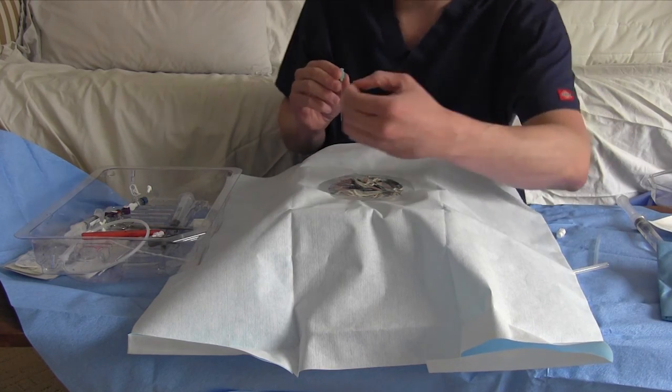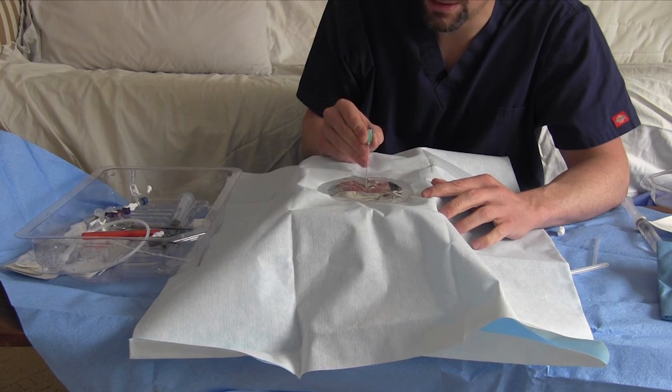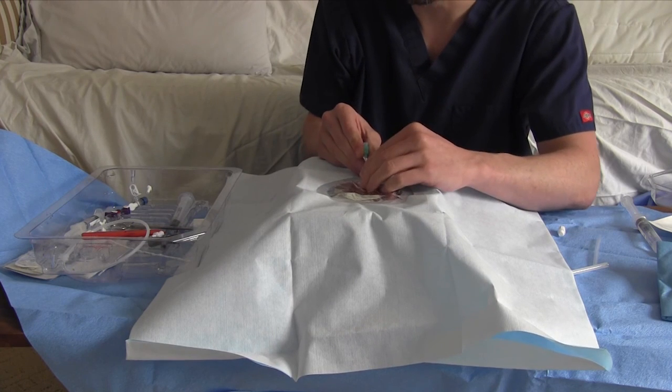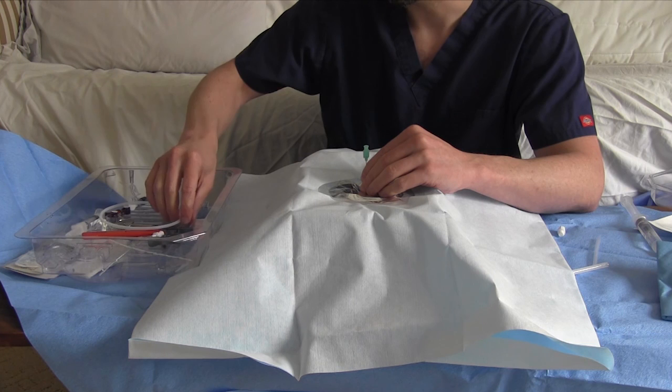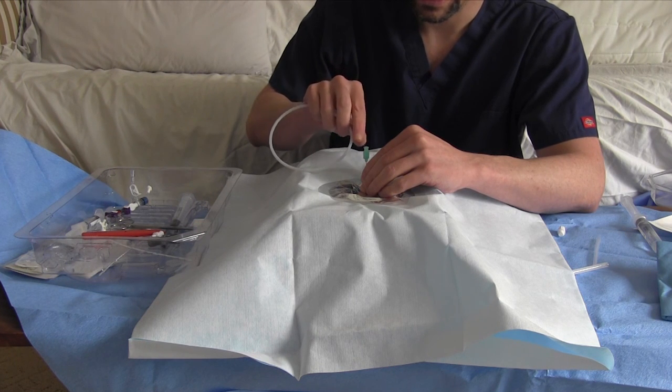So you take your ultrasound probe, pop it on there, find your vessel, and now I've got blood coming out of my needle. I'll hold my needle so it can't move. I'm going to now take my wire and advance the wire.